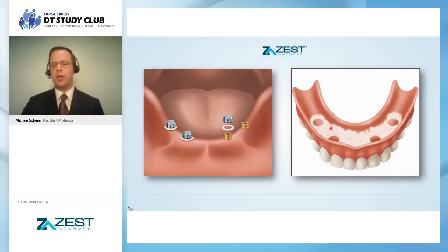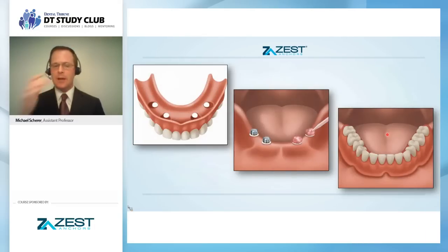I prefer Fit Checker. You can also use things like wax rope wax, which works perfectly fine. Some people use AccuFilm or some of the occlusal indicating paper, perfectly fine. This is just a recommendation. I use this in almost every clinical situation because it gives me a 3D assessment of how much space I have. Now, I always recommend creating relief holes.